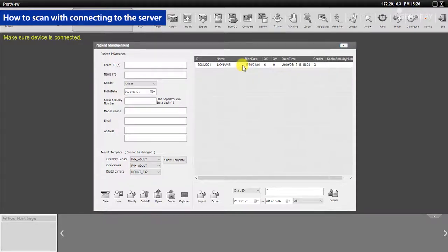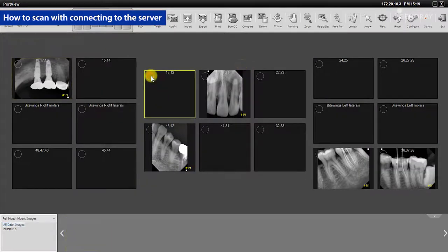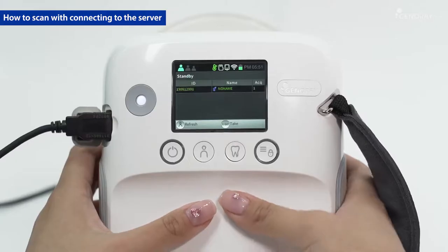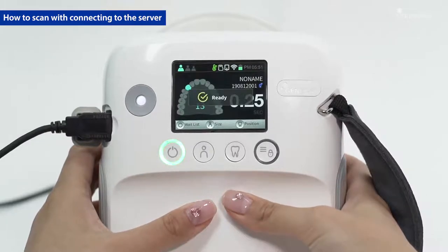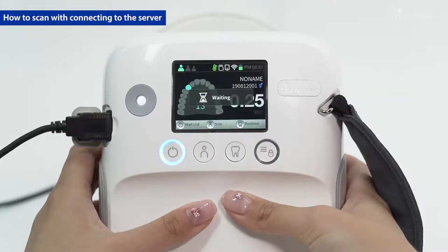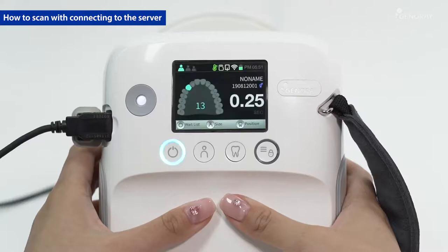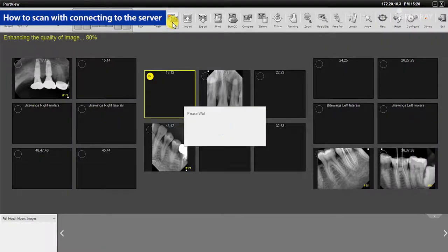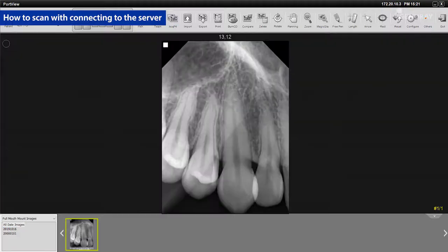In PortView, register a new patient or select an existing patient and prepare scanning from PortView. Select a patient to scan among the standby list. The exposure time is set according to the tooth number requested. Position the beam limiting device of the equipment exactly where to expose and press the X-ray button for exposure. You can have the transferring of your images to your PC automated by setting the preference in the settings window.